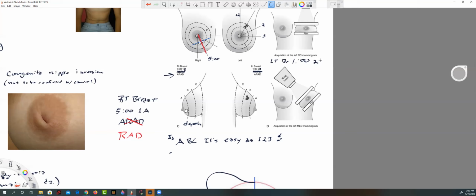B, depth B, and they said ARAD, so let's just go ahead and quickly draw in an ARAD. They must have been holding their transducer like that. ARAD. And I should never have erased that or that. That's okay. We're all human.